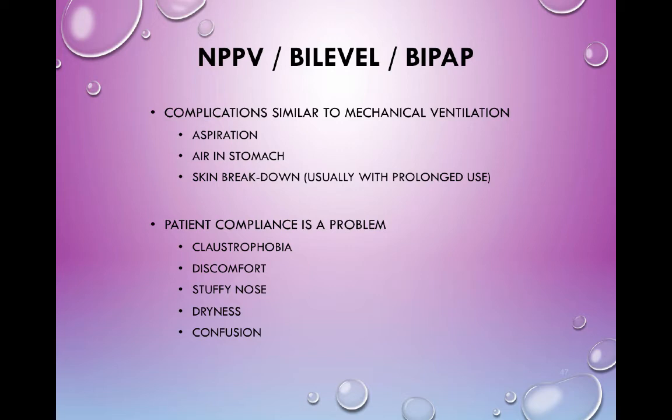Compliance is the other problem. We'll have a patient who we know we can support for the next hour or two while we diurese them, but they just will not tolerate that mask, and so we end up intubating them. And it's a shame. People get claustrophobic. It's very uncomfortable. If you have a stuffy nose and stick that thing on, it's horrendous. I actually wear CPAP. If you have a stuffy nose, it's horrible.